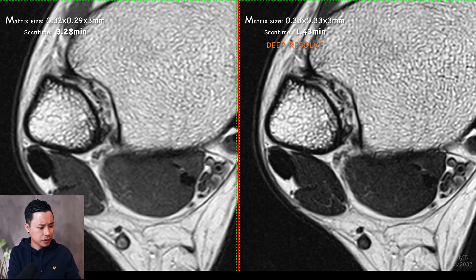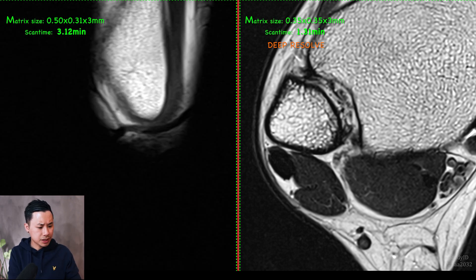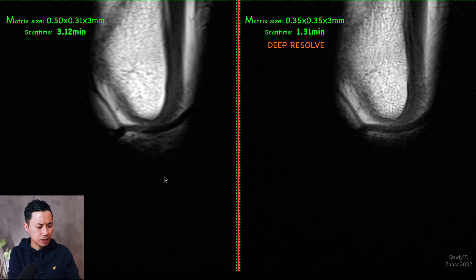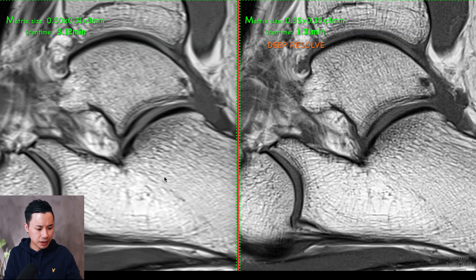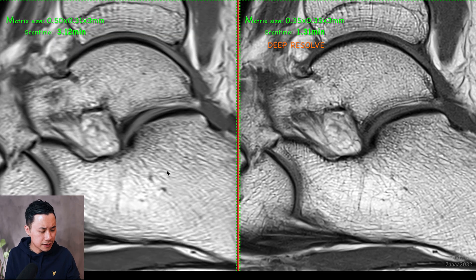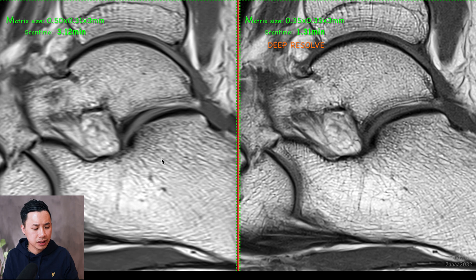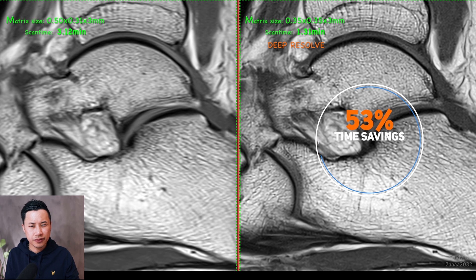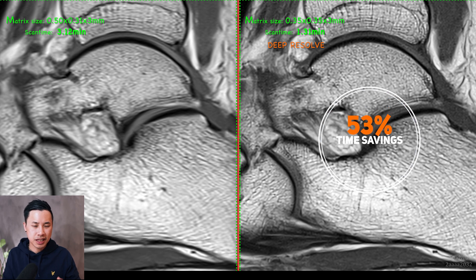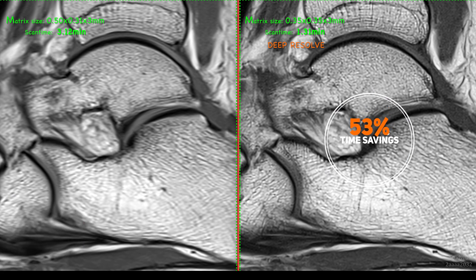Let me show you another one right here. This is a T1, and these images are very zoomed in right now. On the left side, Deep Resolve is not applied, and on the right side Deep Resolve is applied. The scan time difference between these two is around 53% saved scan time.